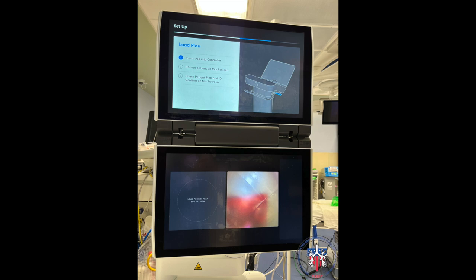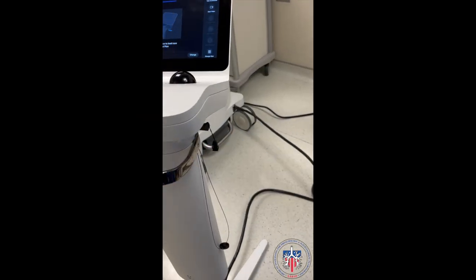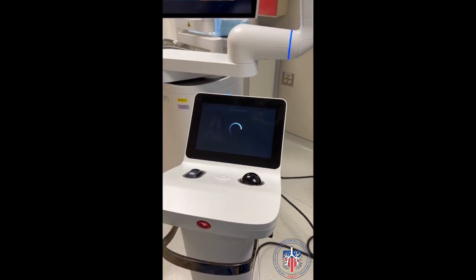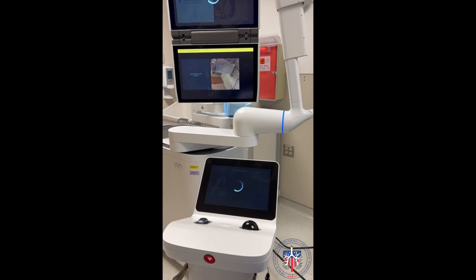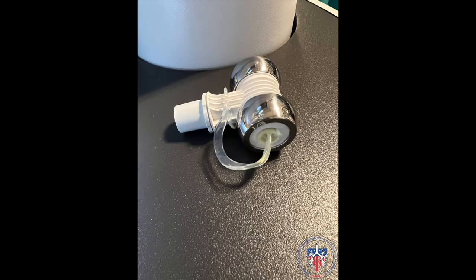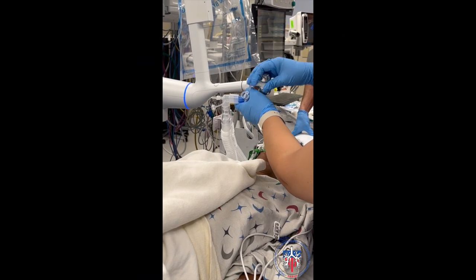The patient plan is loaded by inserting the USB drive onto the controller unit. Select the patient plan to be loaded on the controller unit. The ion system comes with its own specific ET tube swivel connector adapter.